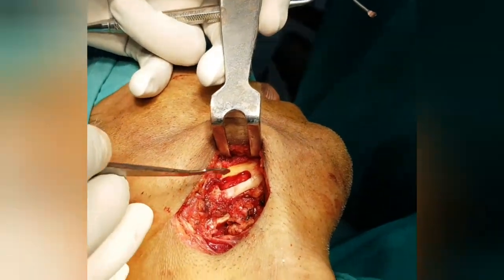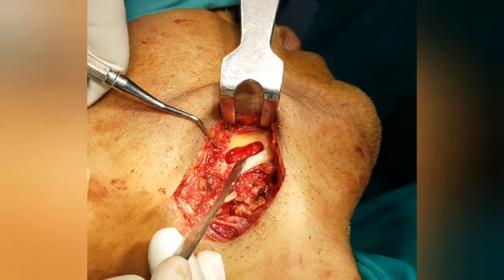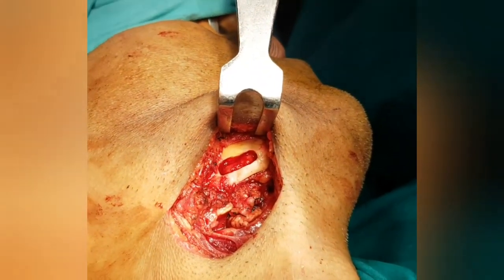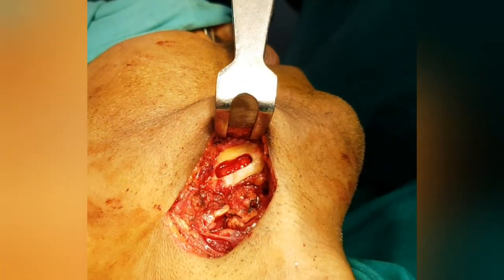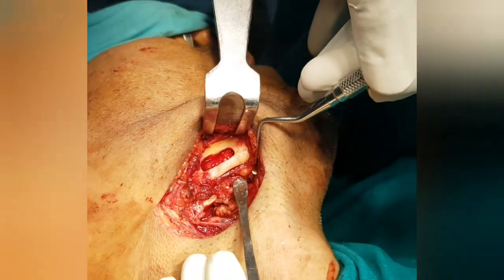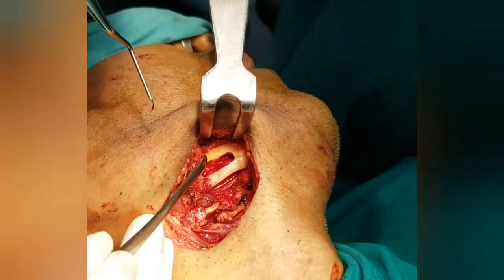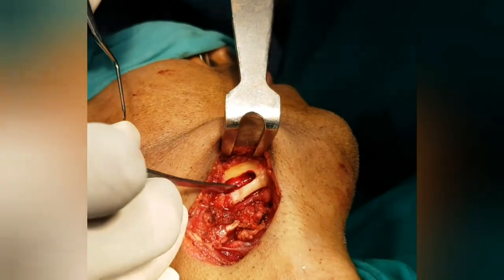Now look here — this is the tumor inside the bone. I created the window over the buccal cortical plate of the mandible and mobilized this tumor from all surrounding structures of the mandible. The lingual cortex has been completely resorbed at the site of the tumor, as you can see here. Once I retracted the lingual portion of the flap, the tumor was also coming out.